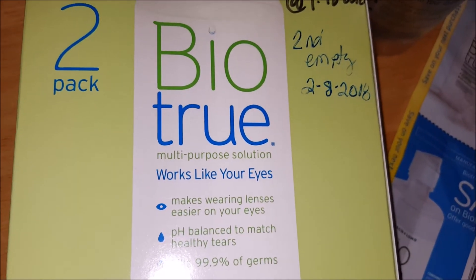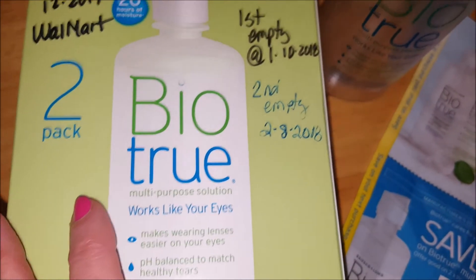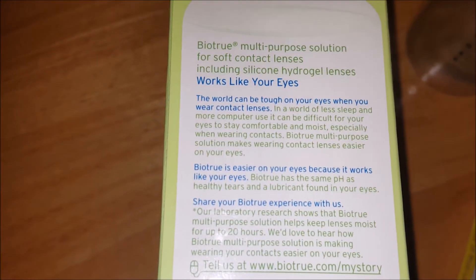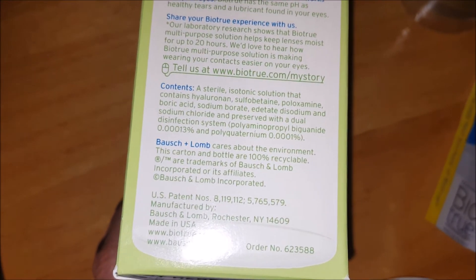I really do like this. It doesn't burn my eyes. It's never irritated my eyes like the different brand that I was told to use by my eye care specialist. I'm just happy with this one. I've been using it for several years now and I don't have any complaints at all.